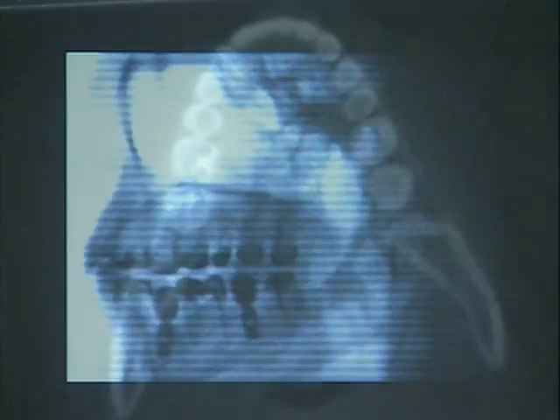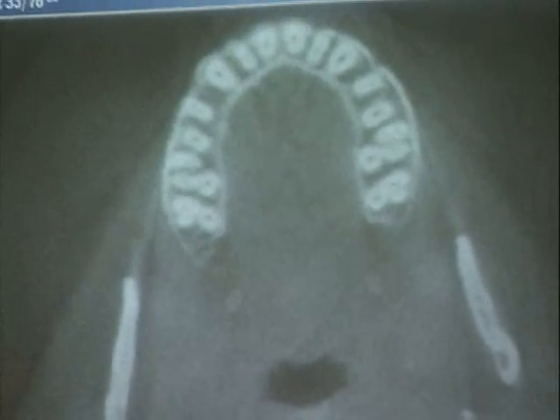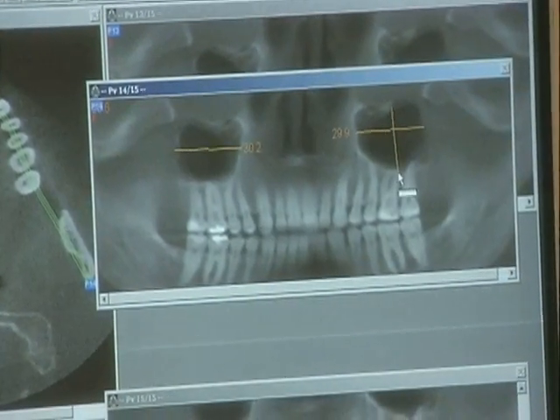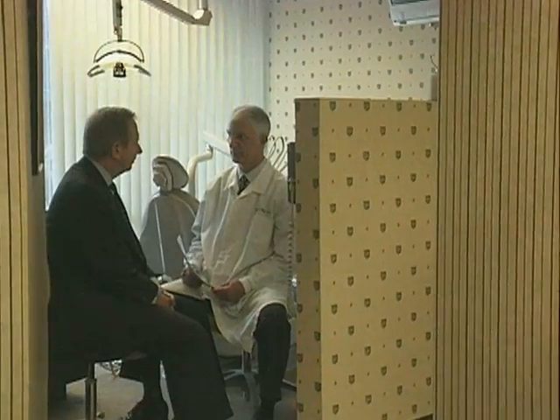From the CT information, we can create 3-dimensional objects, whether they be the entire skull or just pieces of the skull, a mandible or the teeth. And we can look at those things in 3-dimensional space for the dentist, so he can look at it in directions that he's never seen before. Because we have an accurate capture of anatomy ahead of time, we can design the end result ahead of time. What's phenomenal about this is the opportunity to provide care for a patient that's far more comprehensive and precise.